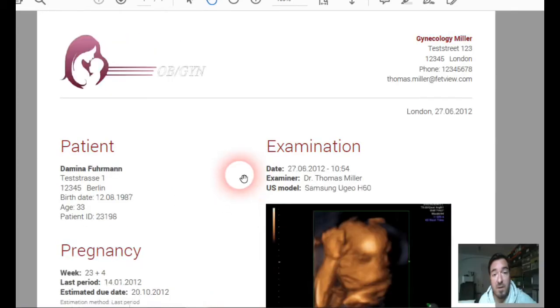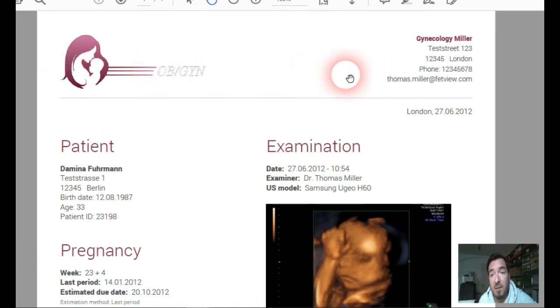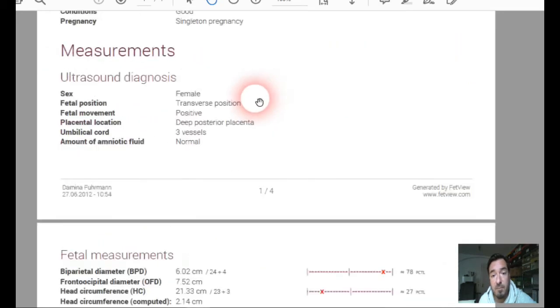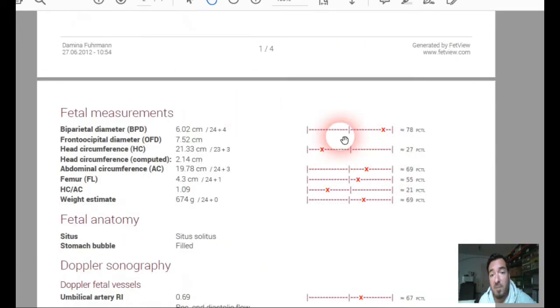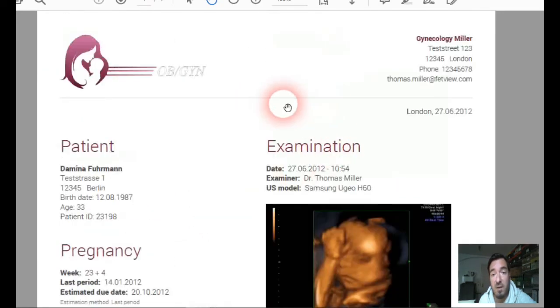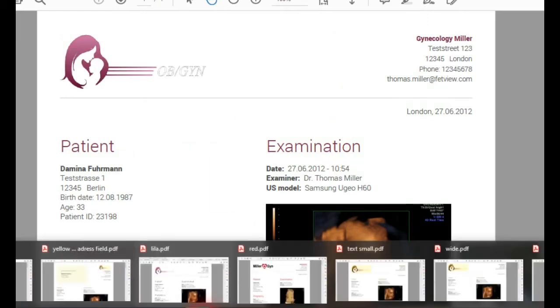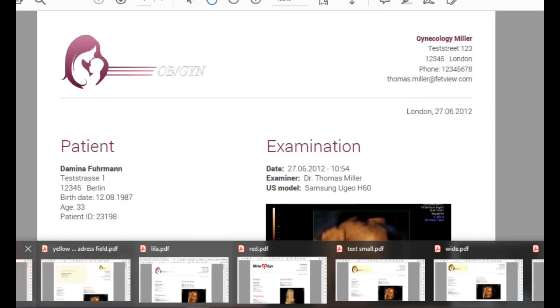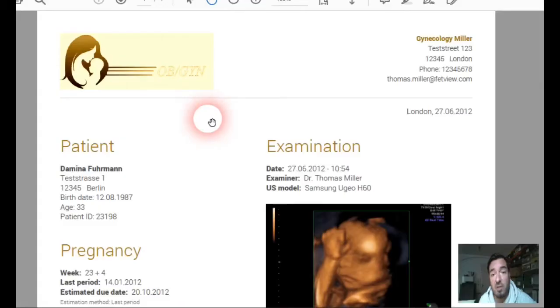Here we go with another color. Again, the percentiles are also in the color. As you can see, you can change the size of the text. Here we have a big one.